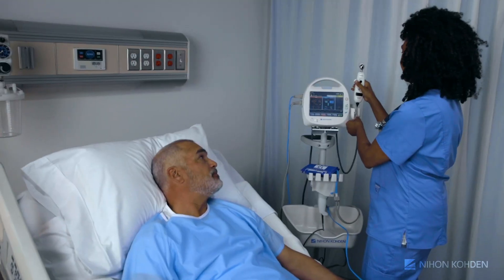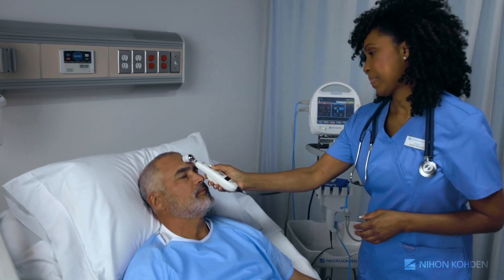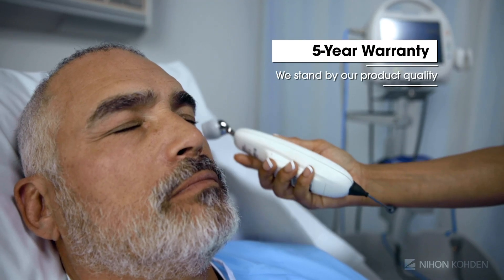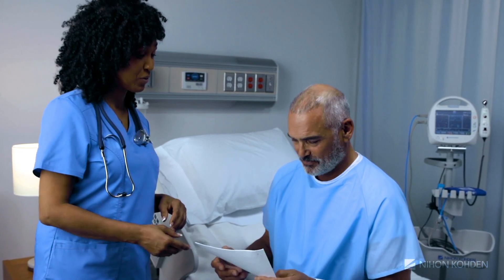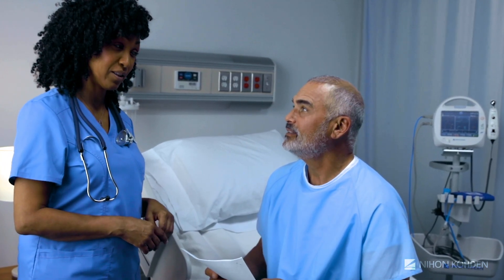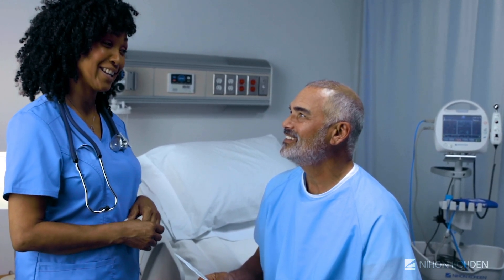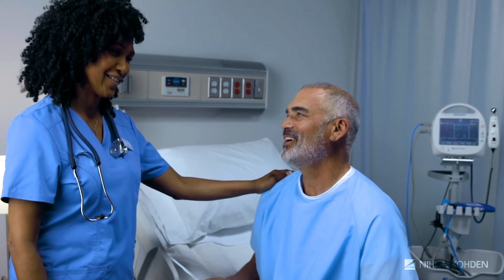Boasting the same industry-leading quality NeonCoden is known for, the LifeScope SVM7200 is backed by an unrivaled five-year equipment warranty. NeonCoden's LifeScope SVM7200 Vital Signs Monitor is a smart and simple solution that saves time and increases efficiency, which allows clinicians to spend less time charting and more time with patients.